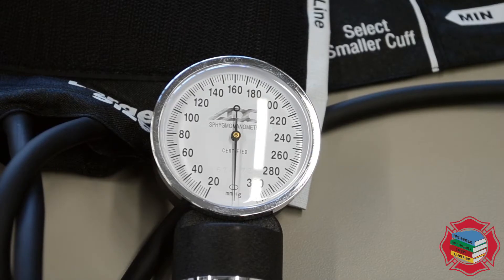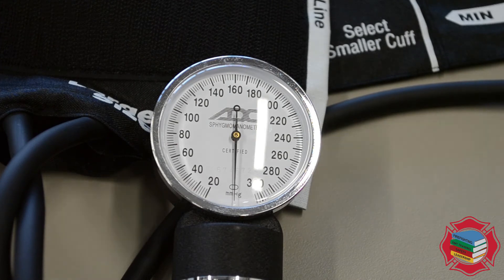Zooming in on the sphygmomanometer, on closer inspection you'll notice that the hash marks are in increments of 2. This means when you're recording your manual blood pressures — whether palpated or auscultated — it is important that you don't document odd numbers, because technically you can't get an odd number on a manual blood pressure cuff. Automatic blood pressure cuffs, however, do have the ability to give you odd number readouts.